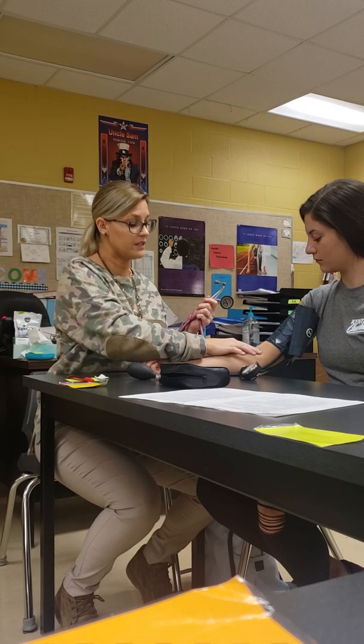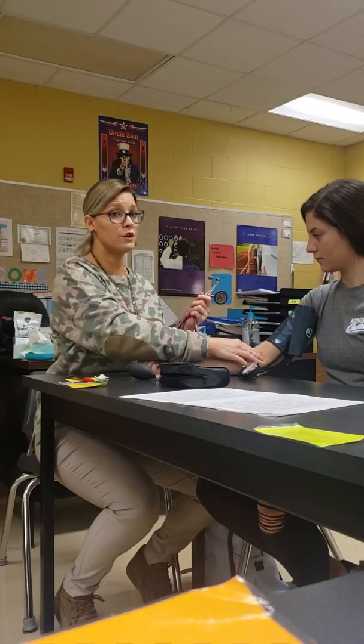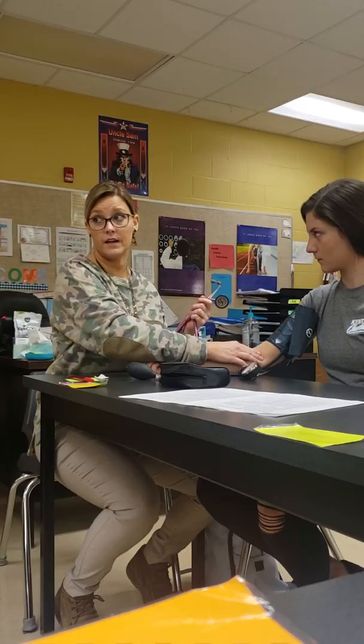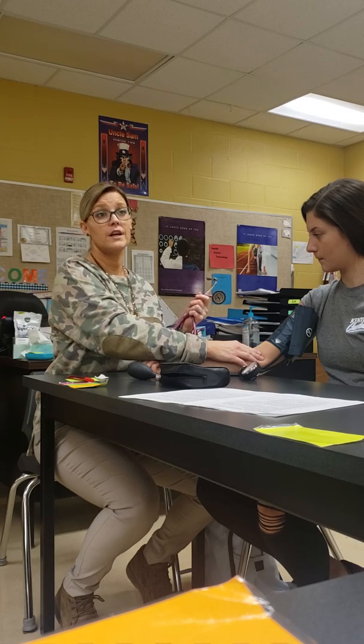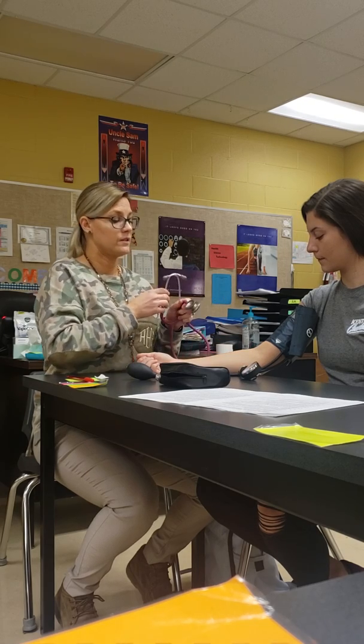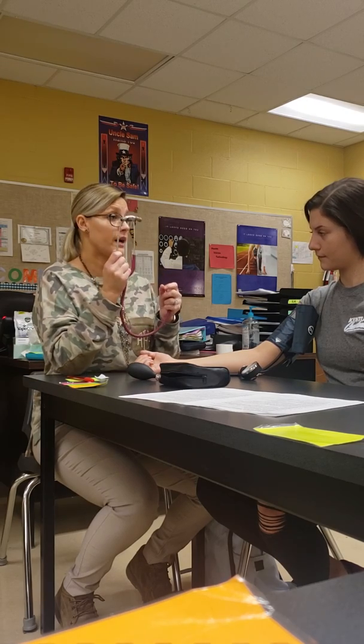I'm going to go to the center of the bend of the arm, and then I'm going to go slightly off center. If you go too far off center, you're not going to hear anything. If you go straight in the center, some people will hear a blood pressure and some people won't. So you make sure you have the stethoscope in the correct place. Okay, I've located the brachial artery.